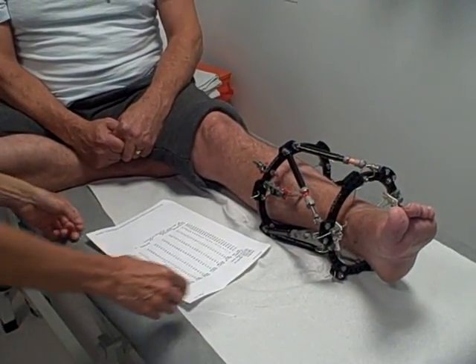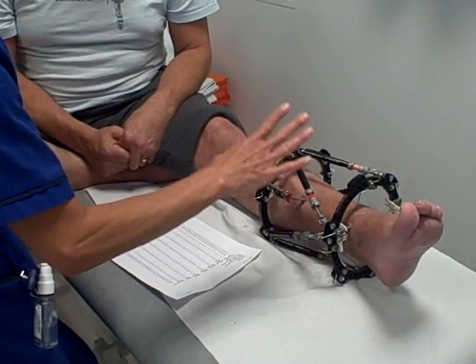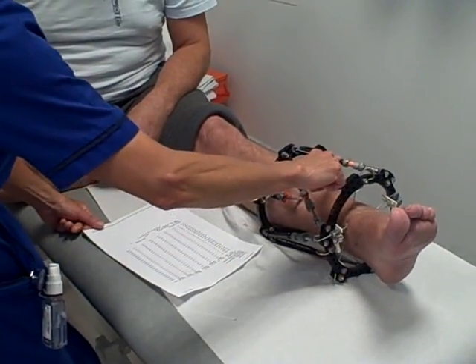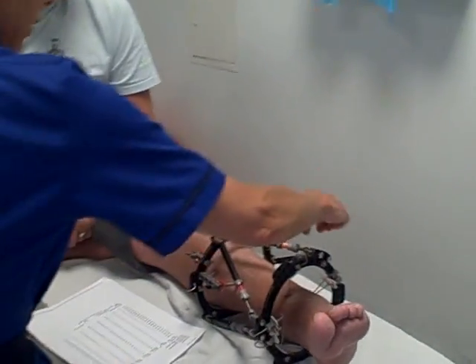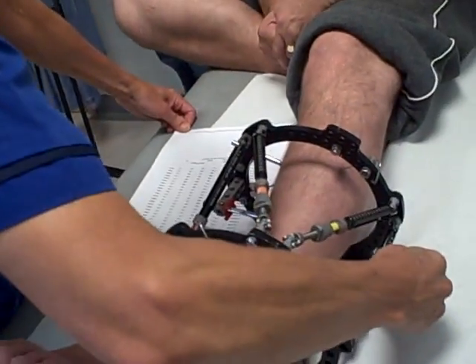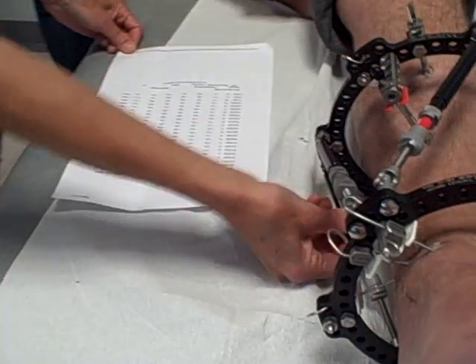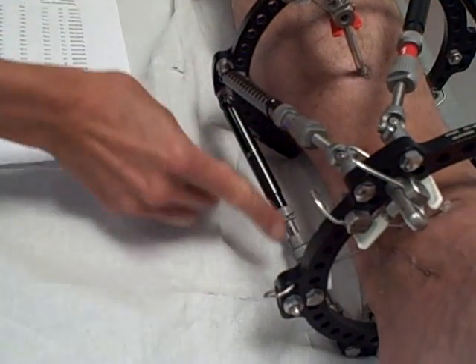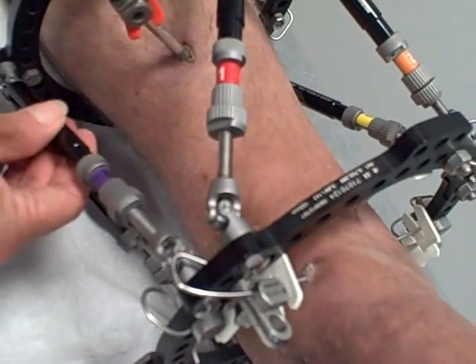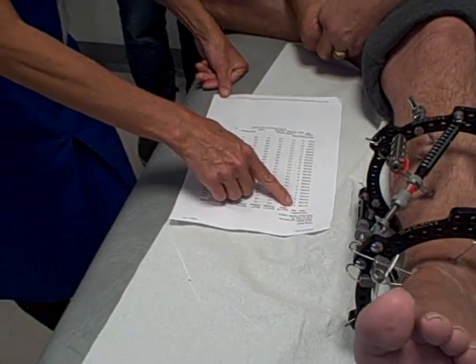Okay, thanks very much Debbie. So John, here's your prescription. We've got six struts: strut one is red, strut two is orange, strut three is yellow — you can see the colors. Strut four is green, which is around the back there. Strut five is blue, which is round here — it's lost its color label but we know that's fine, it comes after four. And strut six is the violet. Was that fairly simple? Yeah, fairly straightforward.